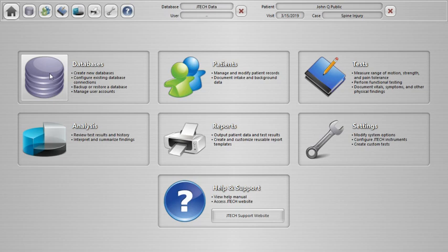But for those of you who are at larger institutions, for our enterprise users at hospitals and universities, we do, through SQL, allow user management, security, auditing, all of those things. Active Directory support also is included in Northstar for that back-end administrative stuff to be handled. We also have some of our own security components that are built in, but that SQL database is a big deal and makes sure that the software is resilient technology-wise and also flexible for those needs. So again, probably not something that'll reach out and grab you day to day, but we do like to make sure that you know that we have some of those technology considerations in mind as we develop the program.